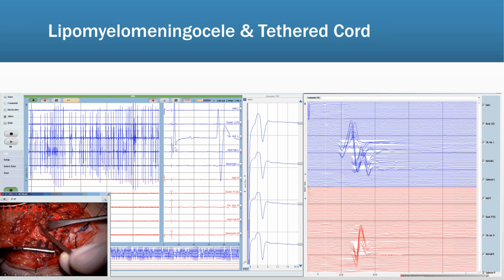In this picture in the middle, you can see the trigger EMG responses. They are up in two places, so that's not a trigger EMG response. It is a response to the stimulation artifact.